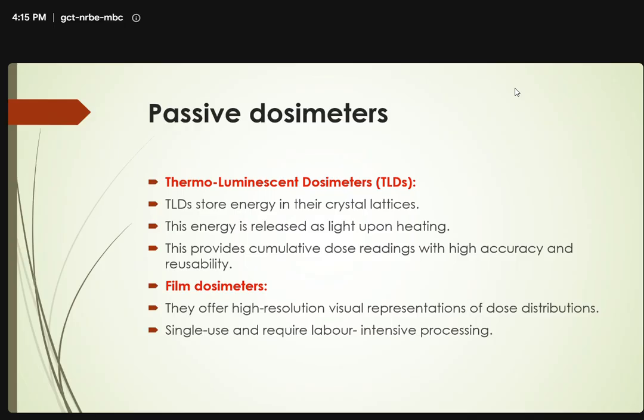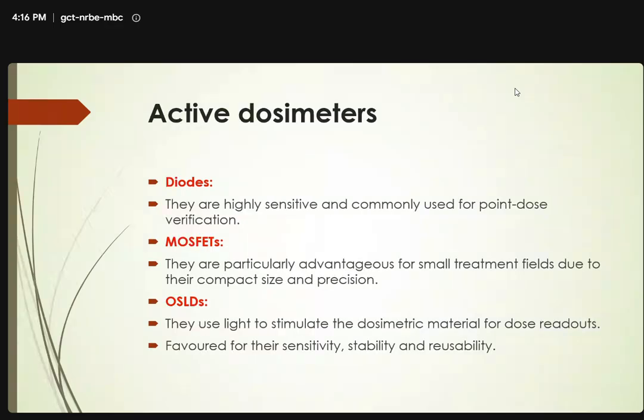Whereas film dosimeters offer a high resolution visual representation of dose distribution, and they are single use and require labor intensive processing, so they have these kinds of challenges.